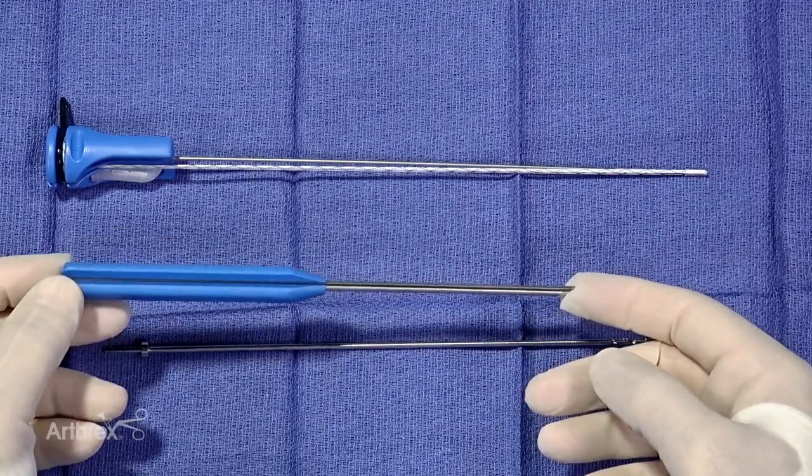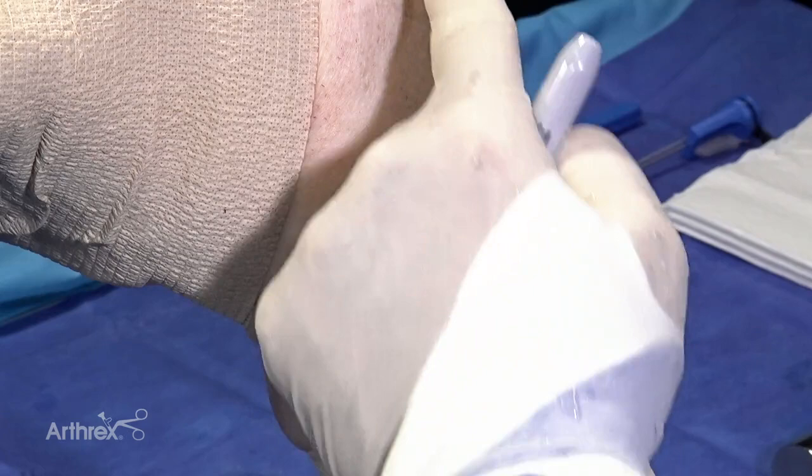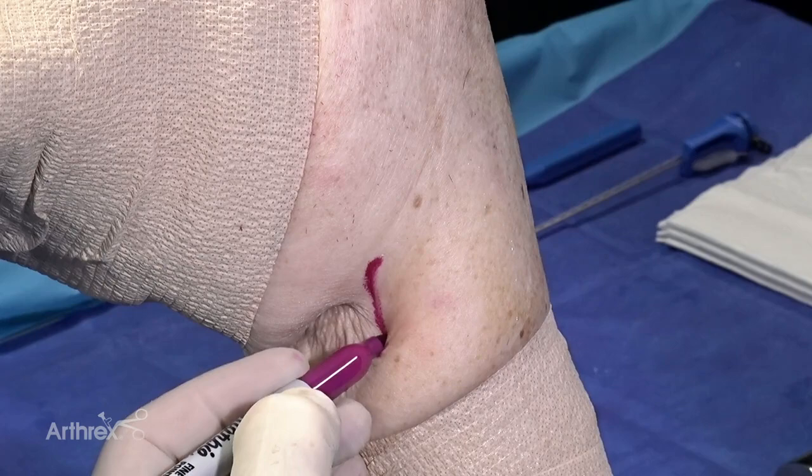So for a subpectoral biceps tenodesis, ultimately we want to still be above the latissimus, but some of your landmarks are the axillary crease, the anterior border of the deltoid comes across here, the pec comes across here, and you can make this incision very cosmetic so that it's more towards the inner side of the arm and you would only see it in high degrees of external rotation. So it doesn't require a very long incision in line with the biceps.